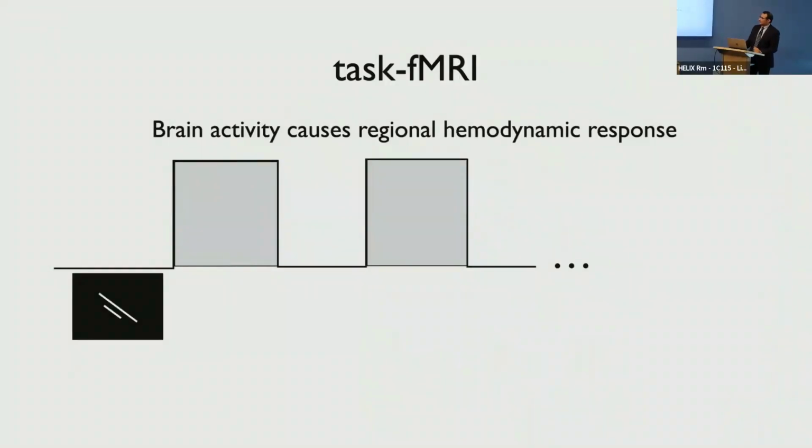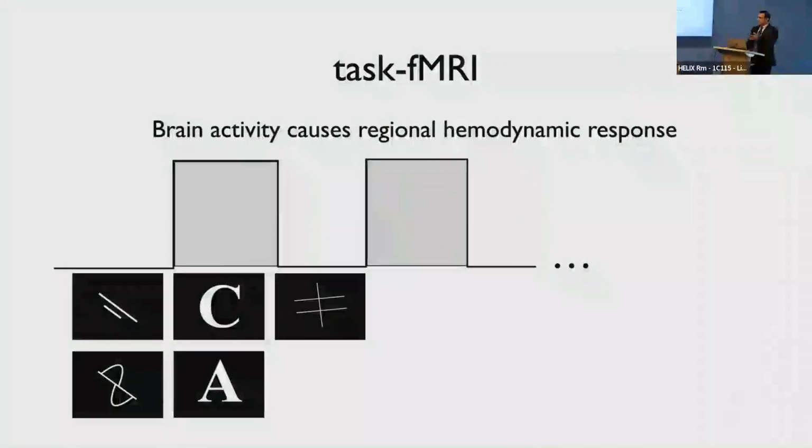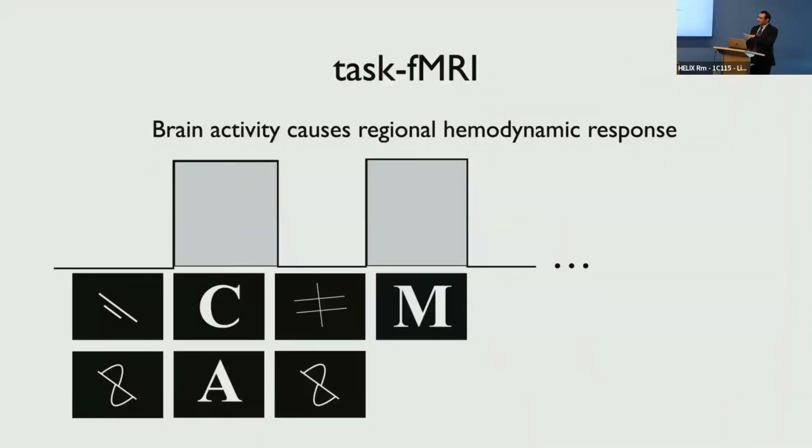So essentially we show patients control images, a baseline, and then have them do certain language tasks. For example, we can show them a letter and say, think of all the words you can that begin with that letter. Then another letter, and they repeat the same thing, and it goes back to control. This is to get rid of all the other stuff happening in the brain, like visual activation and attention system activity. We do this back and forth because the signal is very low.